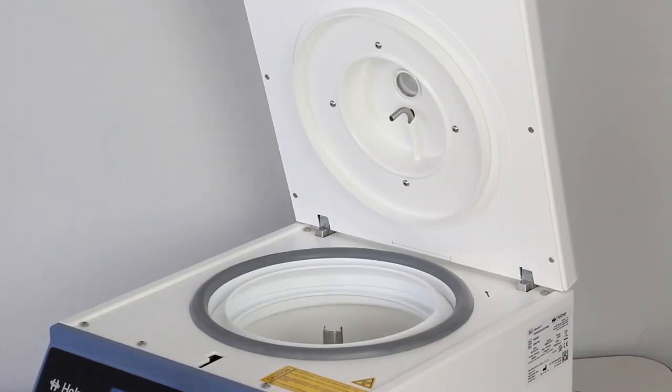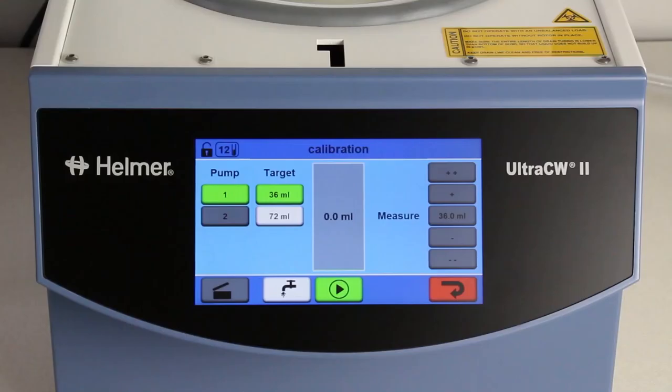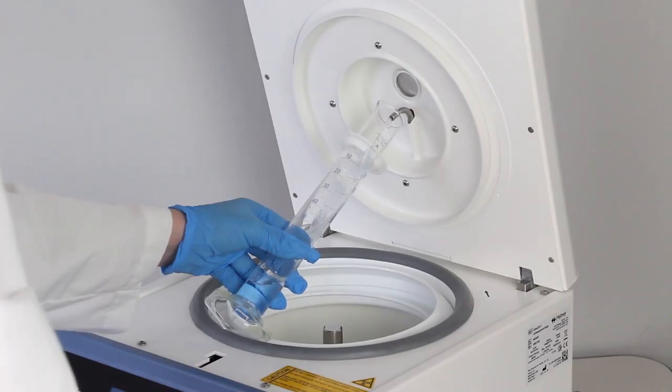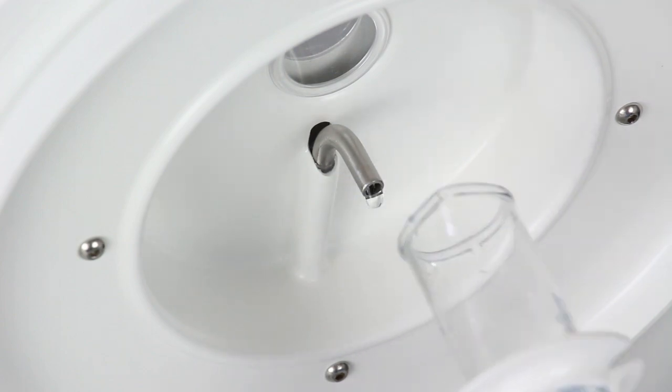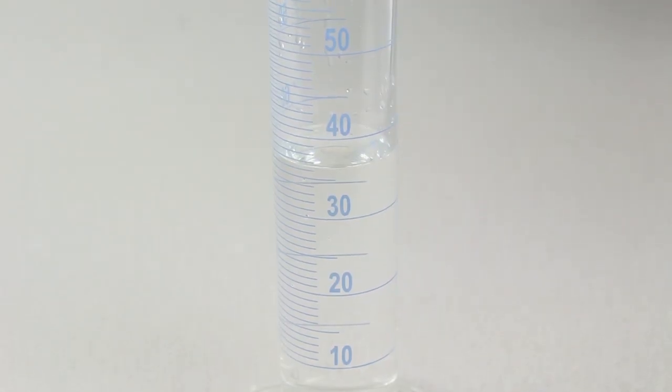Hold a clean, dry, graduated cylinder below the spout on the lid and press the start button. Wait until liquid has stopped flowing from the spout. Measure the liquid collected in the graduated cylinder.